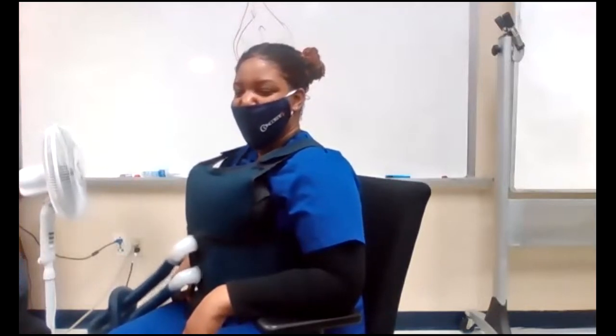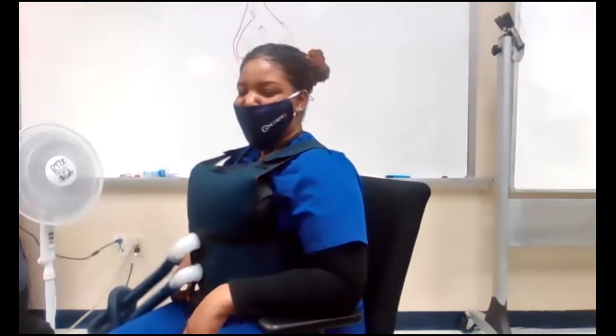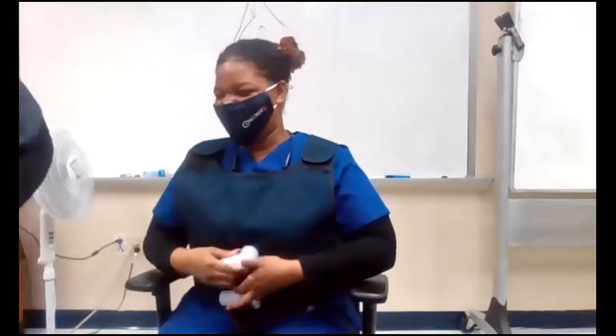And so that's what we use on our cystic fibrosis patients, our people who have a whole lot of secretions who can't get them out. If these devices don't work, we can use the chest vest. I turn it off, and it will start to deflate. So pull them off of there, and that's it. It made my nose feel funny. All right. Of all the things, it makes your nose feel funny.